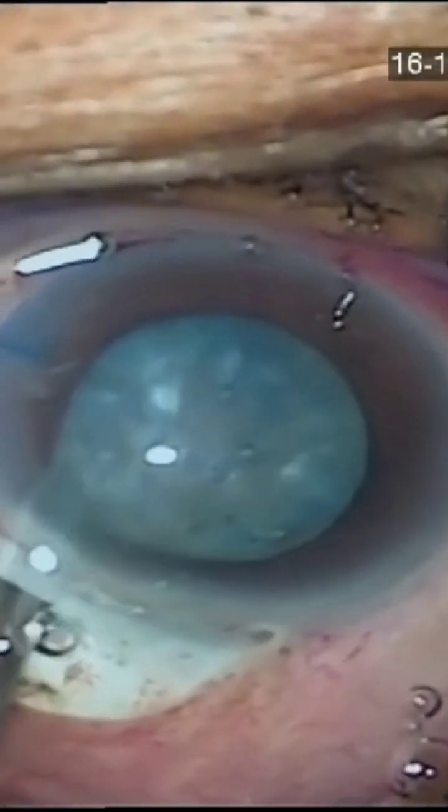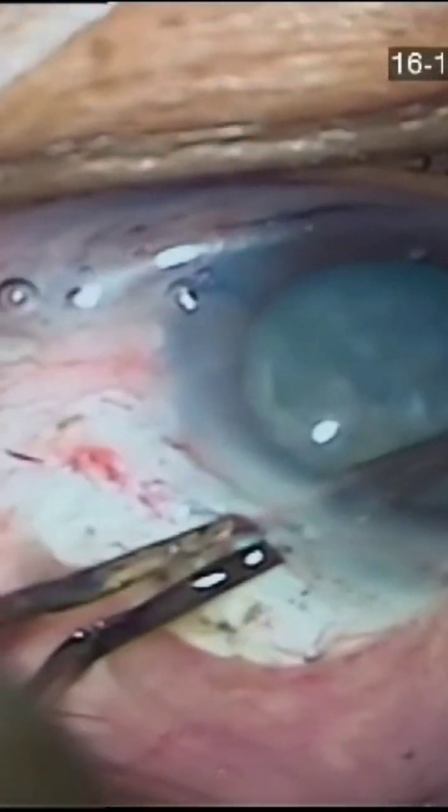Irrigation aspiration is performed with lower bottle height. Most of the cortex is irrigated and expressed. Do not try to pull the cortical fibers before IOL implantation.